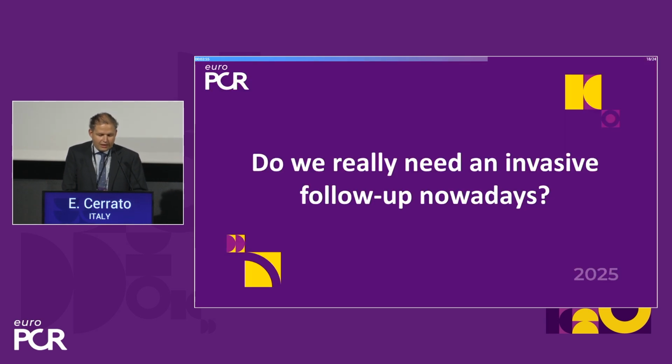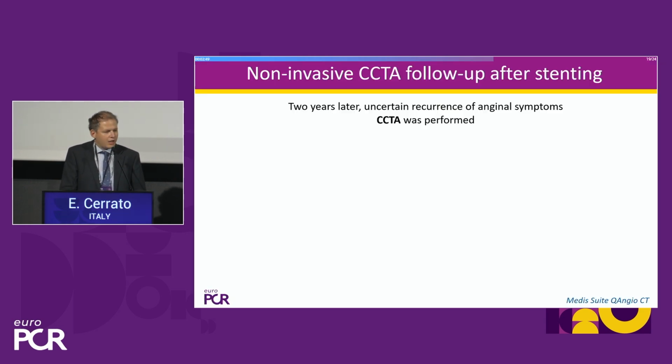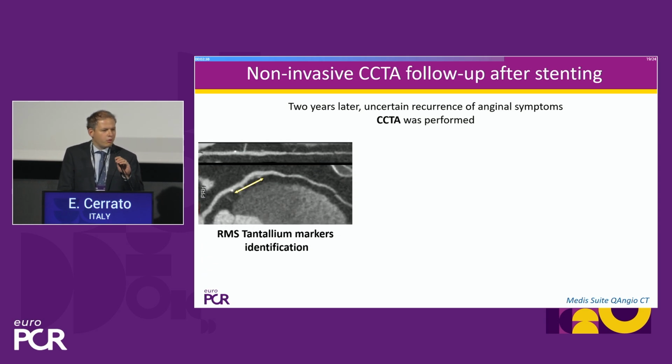But we don't really need nowadays to perform an invasive follow-up of those patients. It's clear that we can have another way. We can also use non-invasive CT scan. We already saw today that we can use it to plan the procedure, but in such case, we can also use it to follow up the patient. In that specific case, we have a CT follow-up that could demonstrate that we can identify the tantalum marker of the Magmaris in such patient.